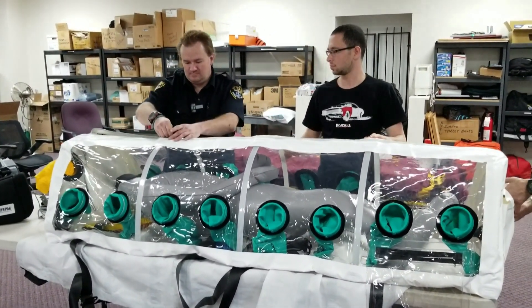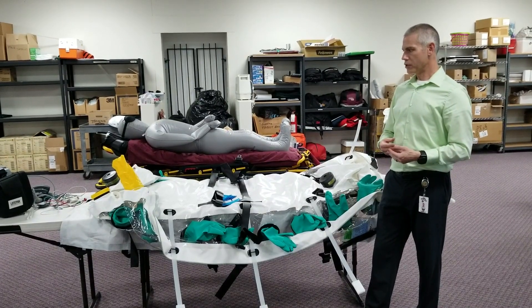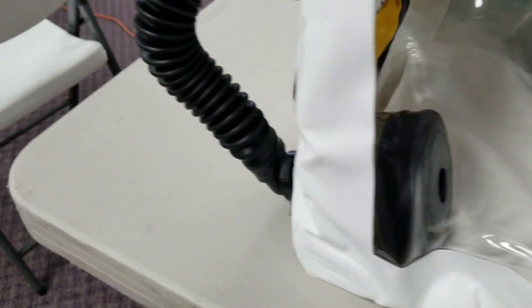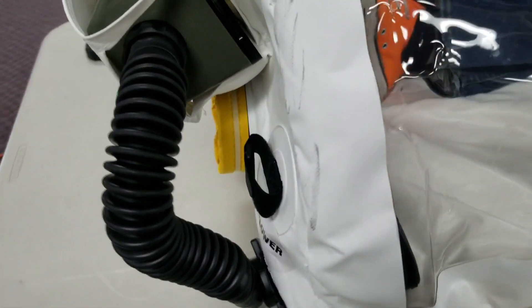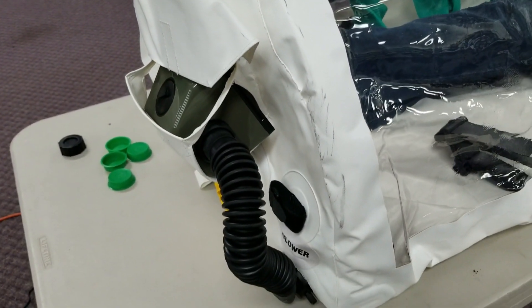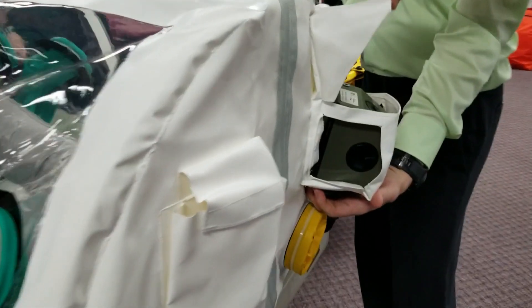So we would monitor a patient, provide them with palliative care, but essentially we're containing them in the isopod for transport. It's a negative pressure vessel, meaning it's constantly having filtered air drawn into it and filtered air removed.